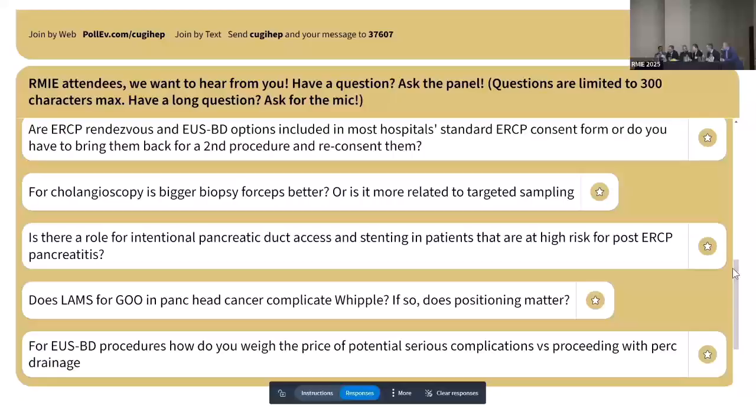So the second wire, 3 millimeters distal from the tip, this is the access direction. The direction is different from the initial wire. So it is easy to perform the double wire technique. It is only a beginning, but it is a dedicated device. So if all the doctors agree the double wire technique is effective, we should develop dedicated devices for this procedure.